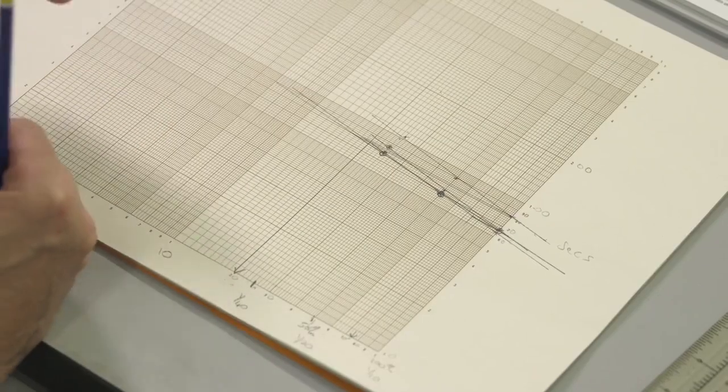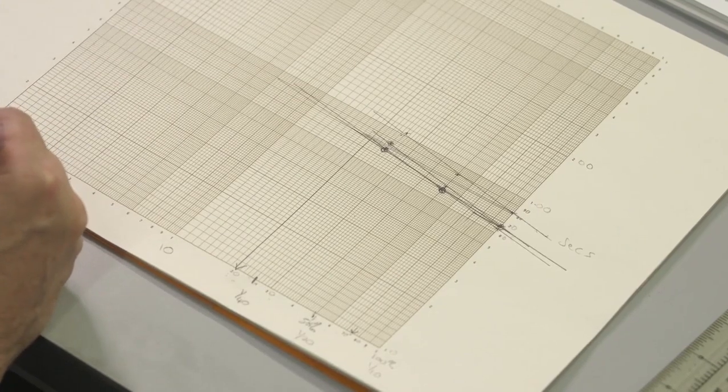We would have underestimated the real factor VIII by about 30%, by about 24 international units per deciliter. That's an important inaccuracy. And sometimes that effect is much more marked. We can see falsely reduced levels in the first dilution. So I think it's absolutely the reason why we've got to use 3 dilutions.